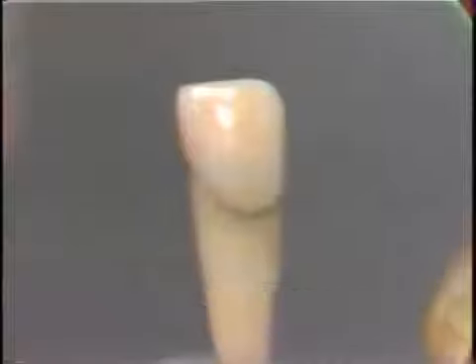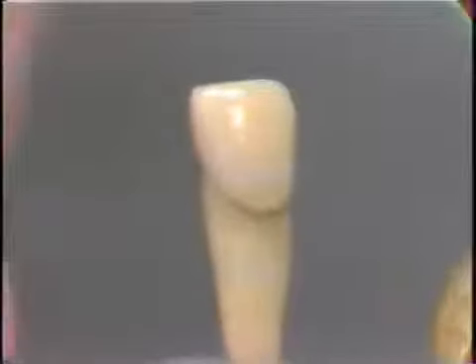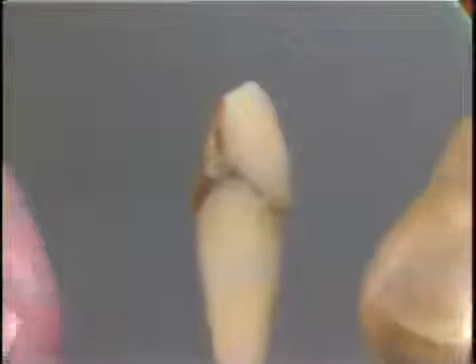And this particular one has an acrylic veneer facing to it, and I think as I turn it round you can see the gold part of the backing and the thin line of gold running around the labial cervical aspect of the preparation. Now this is, just as you see it now, a typical veneer crown about which we have already spoken, and you recognize the difference in the preparation when I remove the crown, that here we have, instead of the normal tooth core of the veneer preparation, a metal one, which is of course attached to a post going down into the root canal.